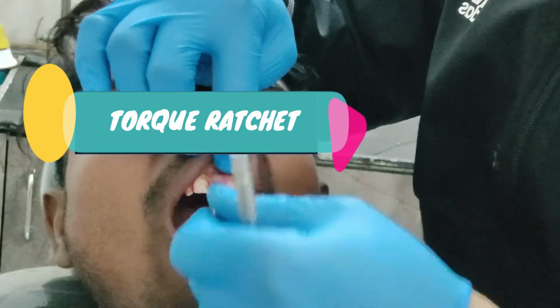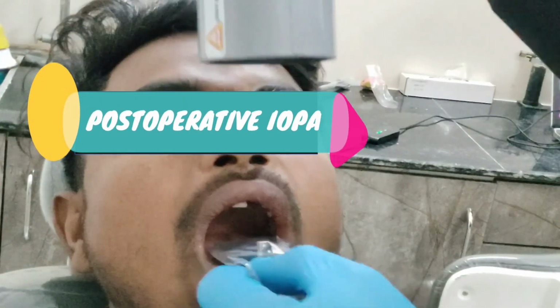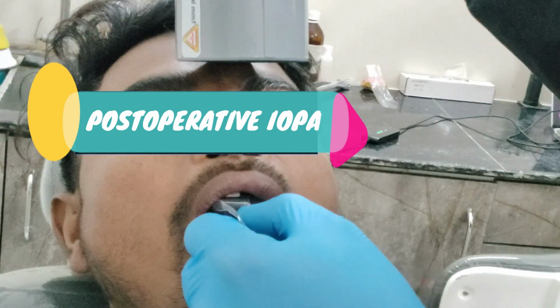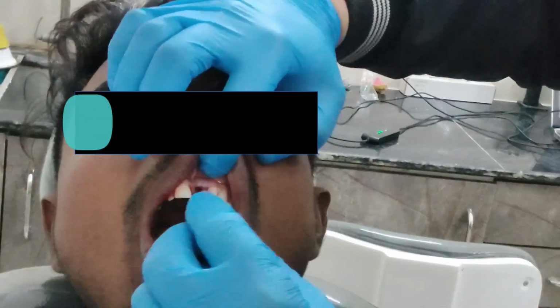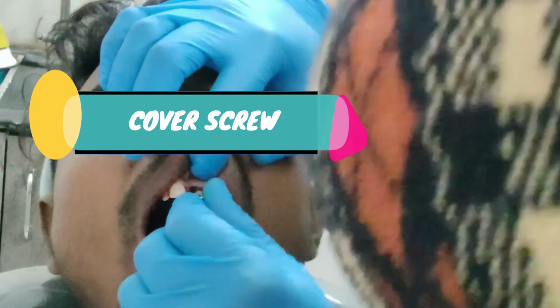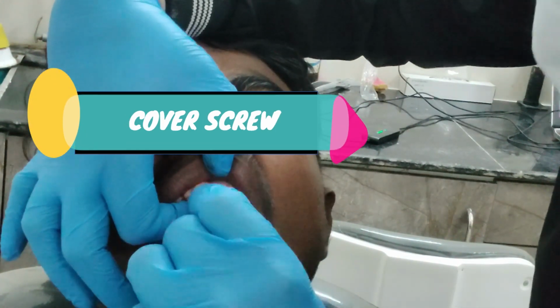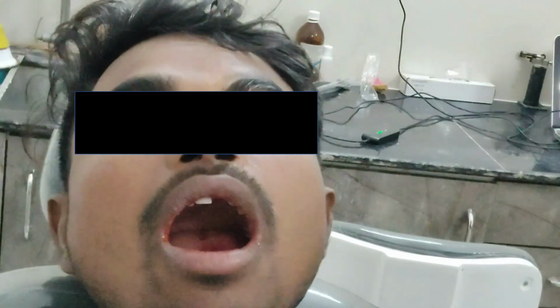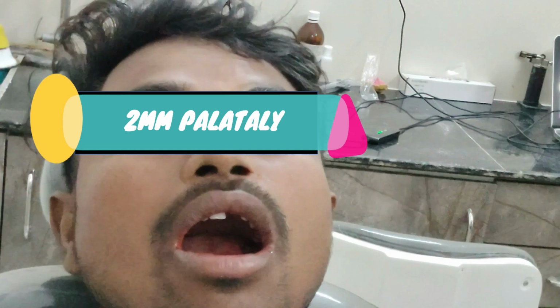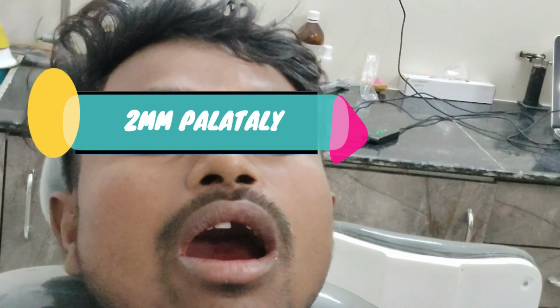After placing the implant, we are going to take a post-operative IOPA to check the angulation and the placement of the implant. And then we are going to attach the cover screw or a healing abutment at the top of the implant. In this case, apicocoronally we don't have enough bone to engage, so we are going to place the implant 2 mm palatally to engage the palatal bone.